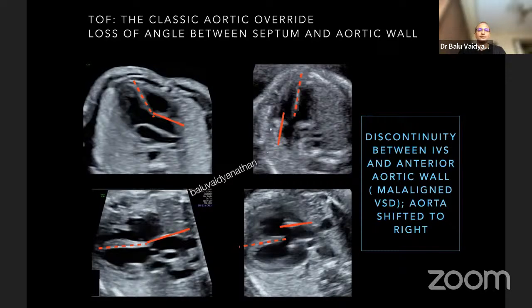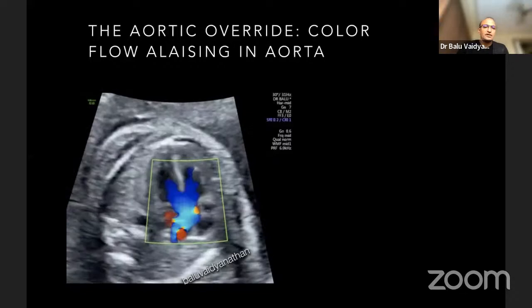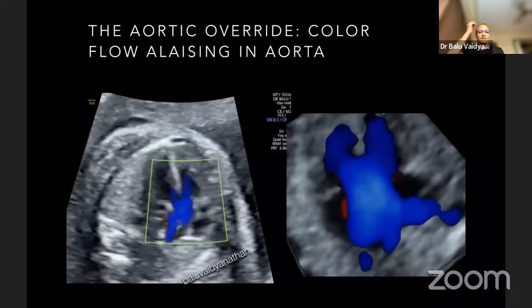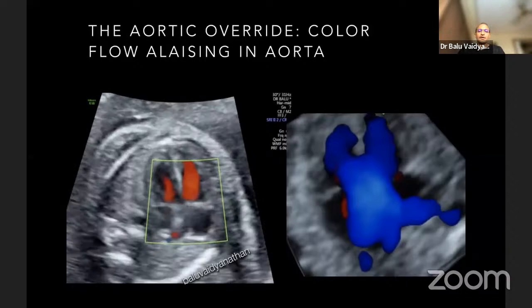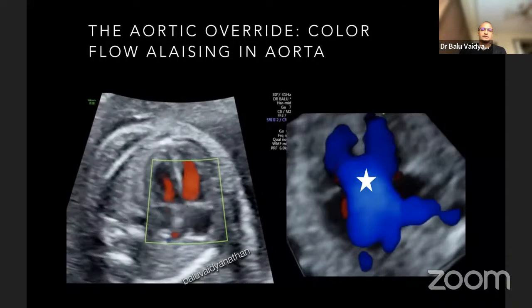The cono-ventricular description is also very good. This is a classical VSD found in tetralogy of Fallot, and you can only appreciate it in the LVOT view — you cannot see this VSD in either the four chamber view or in the three vessel view. When you put color, you find that both ventricles are ejecting into that common single outflow, and often there will be some aliasing of blood due to the larger amount going into the aorta.